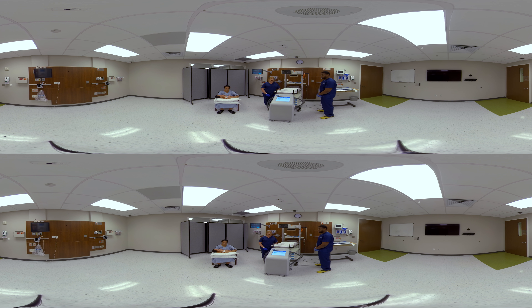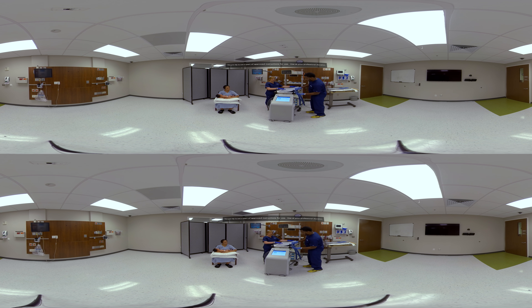We'll begin therapy by getting a neonatal Arctic gel pad and placing it on the bed. You want to make sure you place the pad in the bed with the cloth liner facing up and the blue side facing down. You want to make sure that the hoses are flowing towards the foot of the bed towards the Arctic Sun.